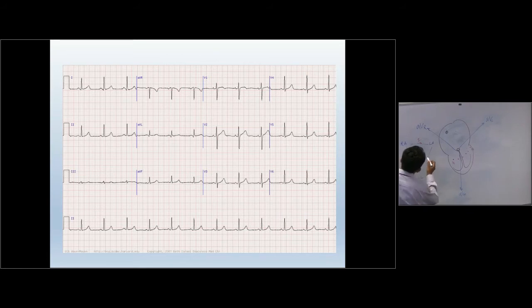So you can link these L letters with numbers. Single letter to lead 1, 2 letters to lead 2, all right, then 3 letters to lead 3. Right? Because we have lots of stuff to remember, so it's better to use shortcuts a little bit. All right? So those are the reasons.